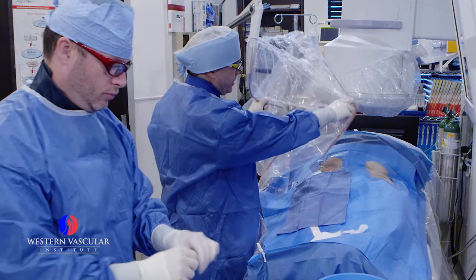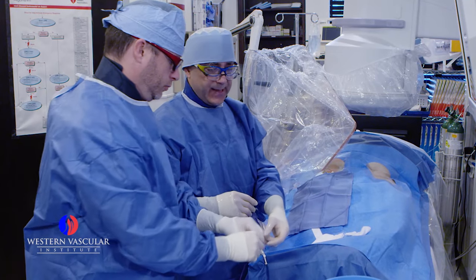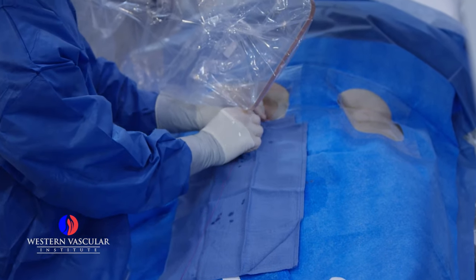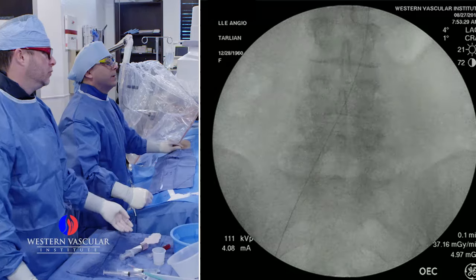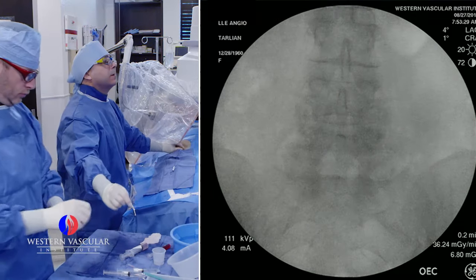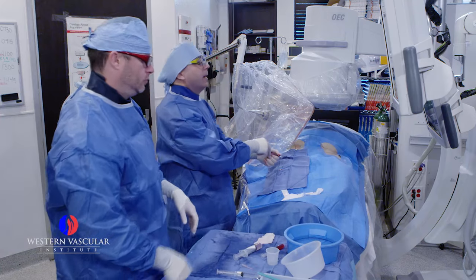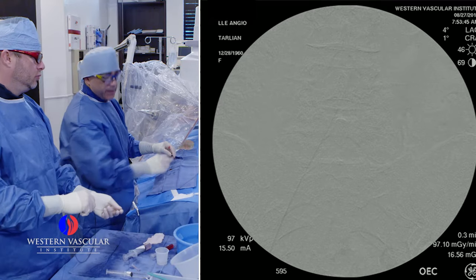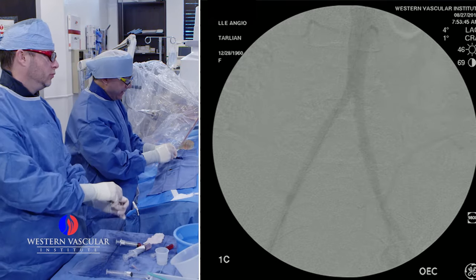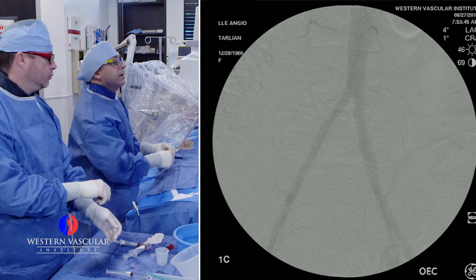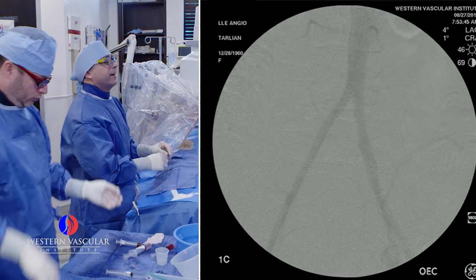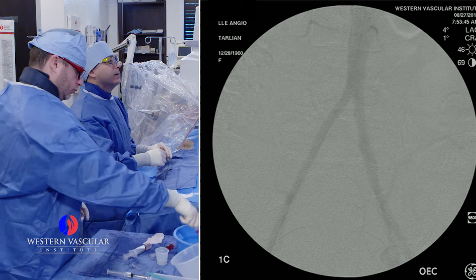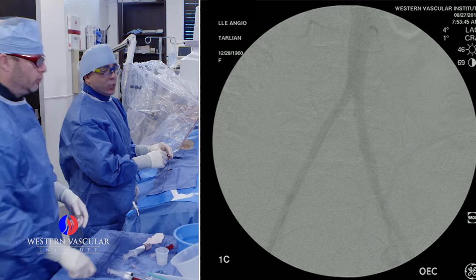Right now we're going to put a catheter inside her artery and take some pictures of her aorta, which is in the abdomen. Here's a nice picture of her abdominal aorta. You can see one big pipe coming down, splitting into two. Symptoms are on the left side. The left side is on the right side of the screen, so what we're going to do is pass a wire over to the left side and then pass a catheter down the left side and take more pictures.